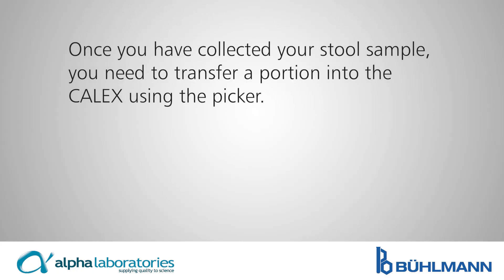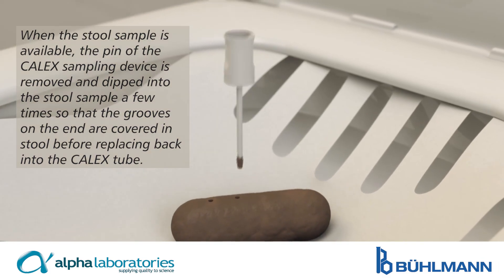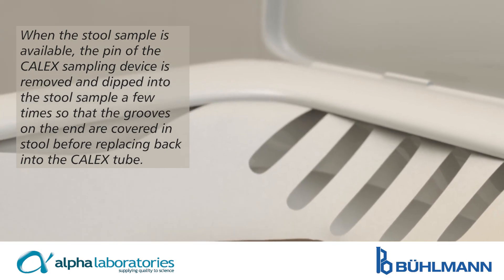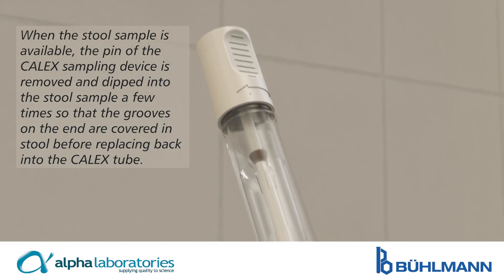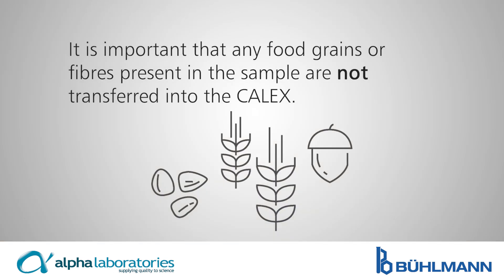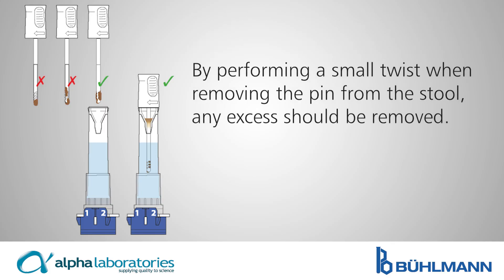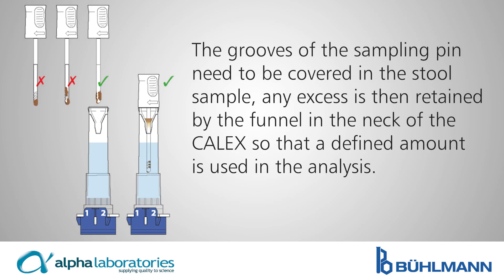Once you've collected your stool sample, you need to transfer a portion into the Calix using the picker. When the stool sample is available, the pin of the Calix sampling device is removed and dipped into the stool sample a few times so that the grooves on the end are covered in stool, before replacing it back into the Calix tube. It is important that any food grains or fibres present in the sample are not transferred into the Calix. By performing a small twist when removing the pin from the stool, any excess should be removed. The grooves of the sampling pin need to be covered in the stool sample. Any excess is then retained by the funnel in the neck of the Calix so that a defined amount is used in the analysis.